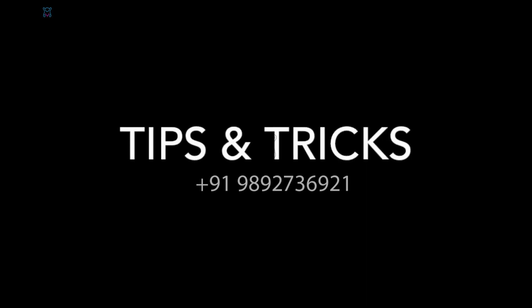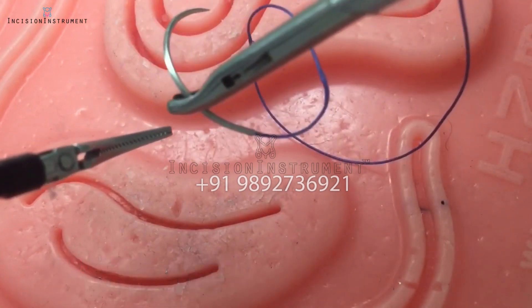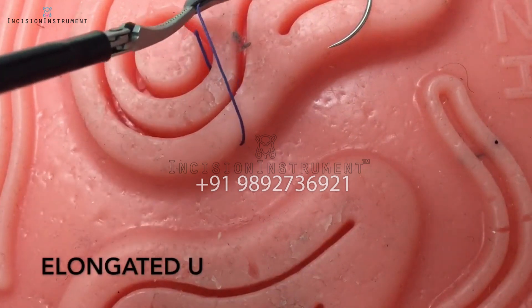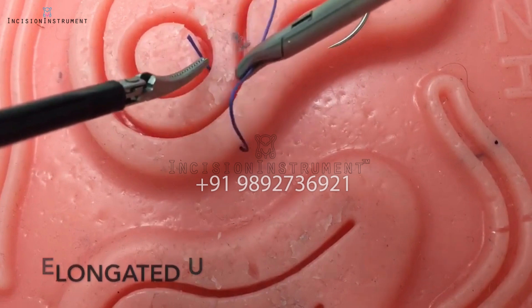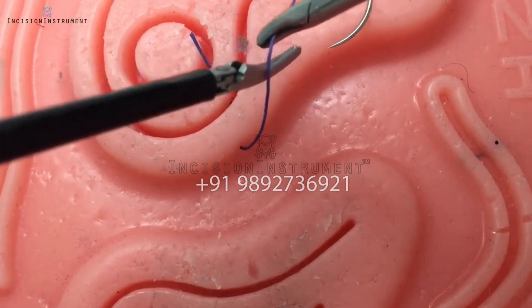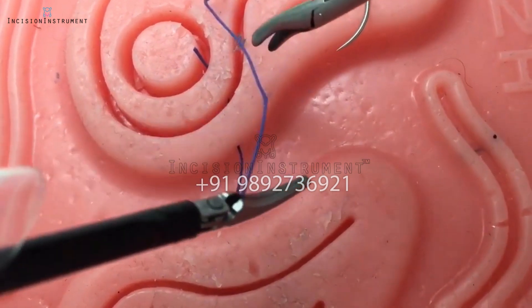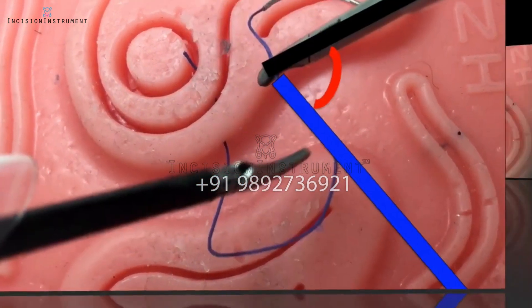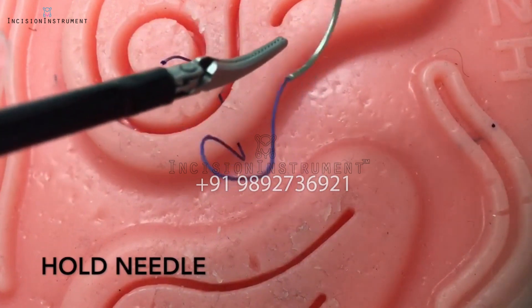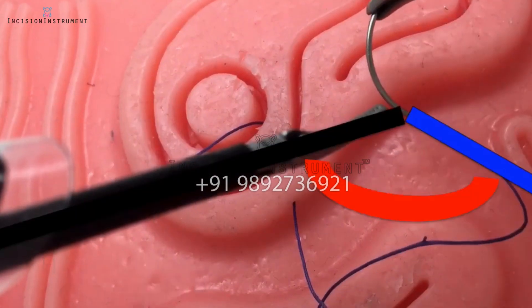Tips and tricks and key points. After loading your needle, always do a practice throw to ensure the needle is loaded approximately 90 degrees to the driver. By creating an elongated U instead of a shortened U, you will not struggle with lack of suture to wrap around your left instrument, and you will be able to avoid a large instrument to suture angle. This is especially important when utilizing ipsilateral port sites that cause decreased instrument to instrument angles. For the hold needle technique, always remember to rotate the needle to line up with the suture and orientate it such that the instrument to suture angle is minimized. As shown, a large instrument to suture angle makes throwing a knot very challenging.